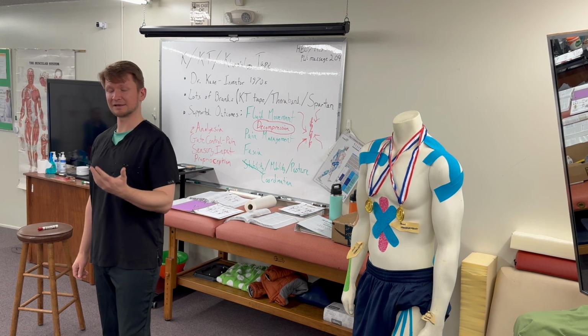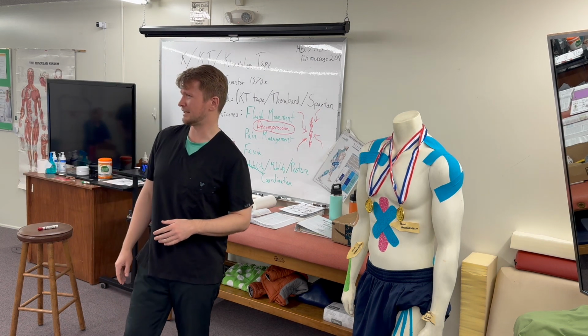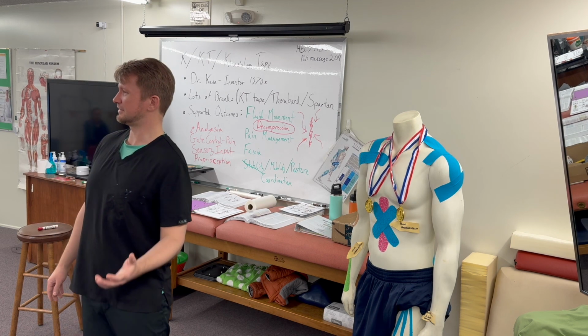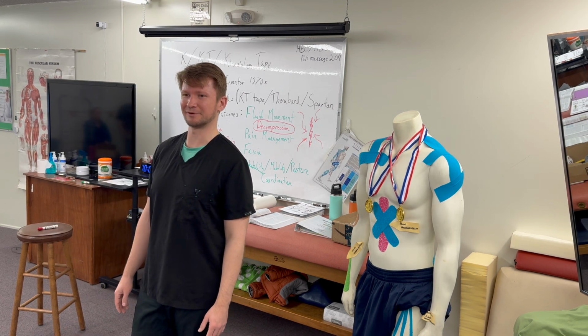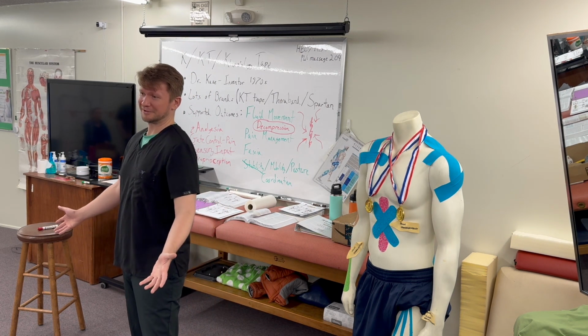So, something I didn't cover, duration. I usually suggest probably not longer than the 4 to 5 day mark. But if people are brave, no, I've totally seen people leave it on for over a week and they're fine. I'm like, kind of gross.